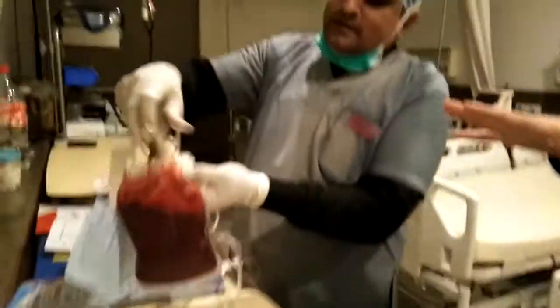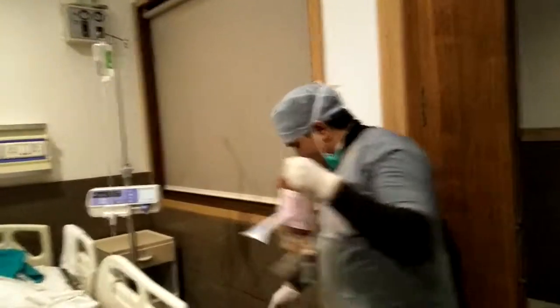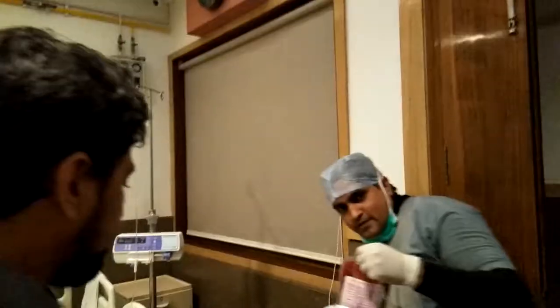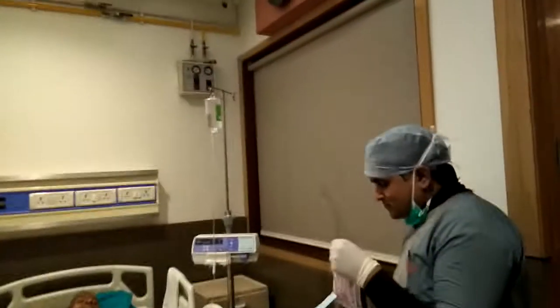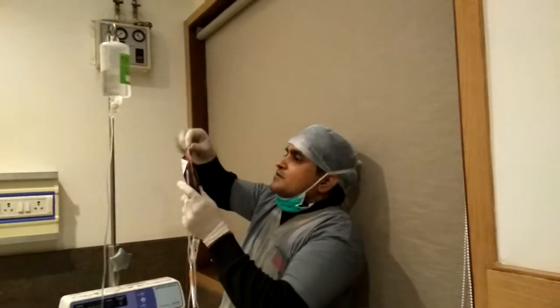We are just showing the vitals and transfusing the blood. He is deficient in blood. We are going to transfuse in cases of anemia, when there is sometimes a loss of blood — that's why we are going to transfuse now.